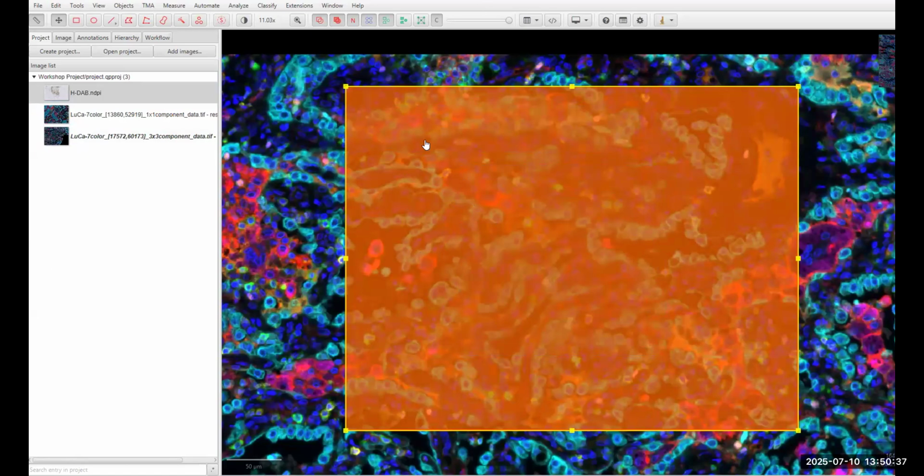Now, if your area is too large, it may pop up with an error saying, attempting to extract this region is likely to require XXX number of megabytes. Are you sure you want to continue? If it's less than a gigabyte, it should be fine. It should have no issues. If you're getting into the several gigabytes, it'll probably fall over. So just be careful with that.